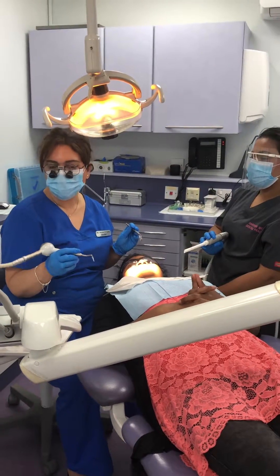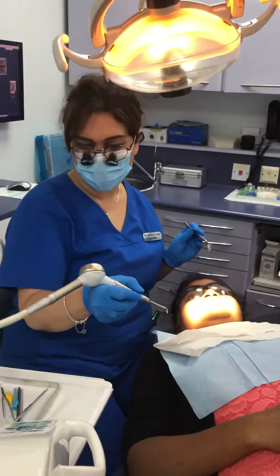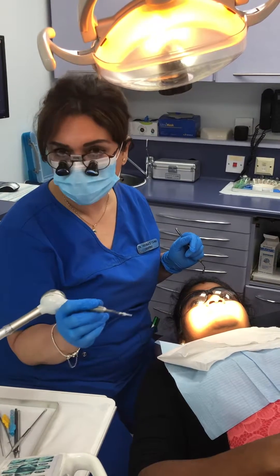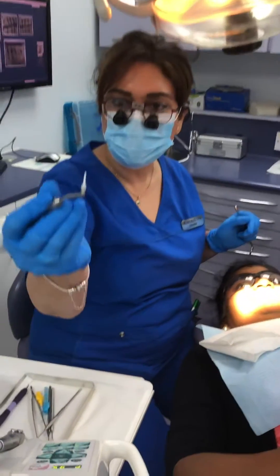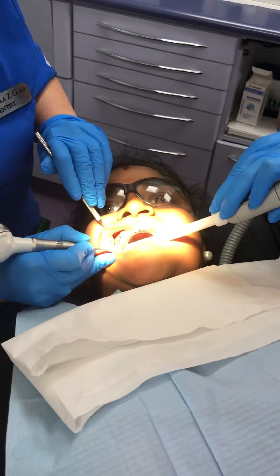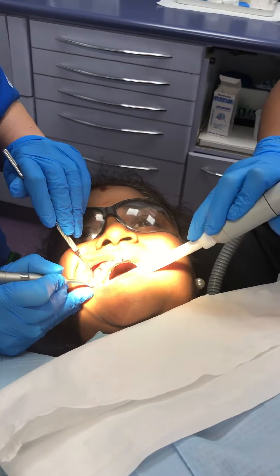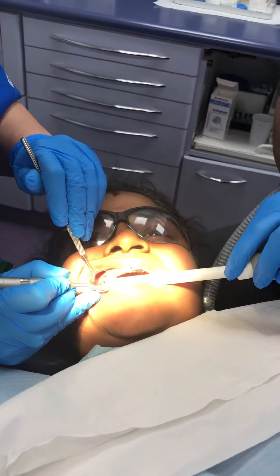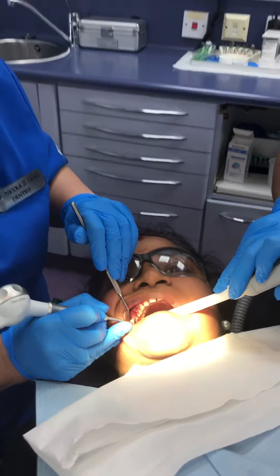Today we are going to use Periomate, which is by NSK, and it's got glycine powder in it. We use it normally for delicate areas to remove biofilm from pockets, from perio pockets, and from around implants. It's got a plastic tip which is just inserted into the pocket, then you press the pedal and deposit the glycine into the pocket — as if you are scaling — and that way it gently removes all the biofilm from around the area. We use it routinely in our practice and it really benefits our patients.